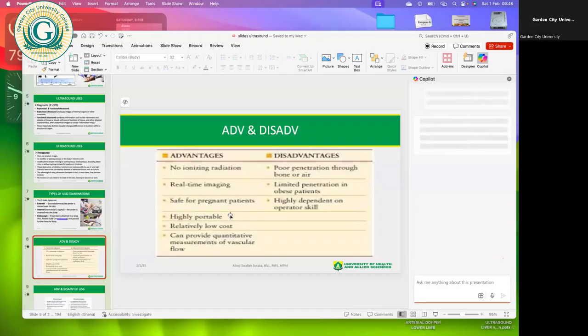Patients of very big body habitus by virtue of obesity are very likely not to be examined comprehensively, and as such, certain skills and maneuvering would be required to visualize certain structures for such patients.